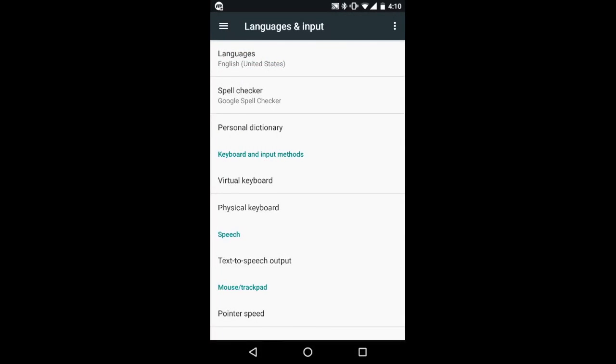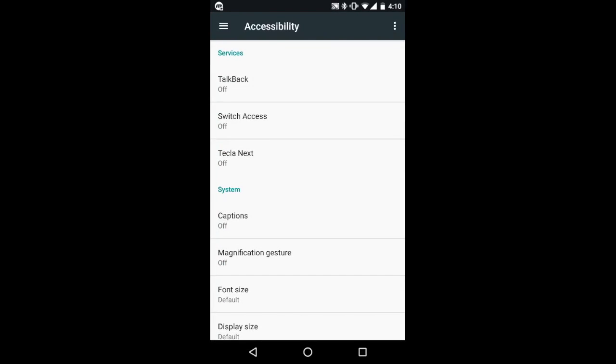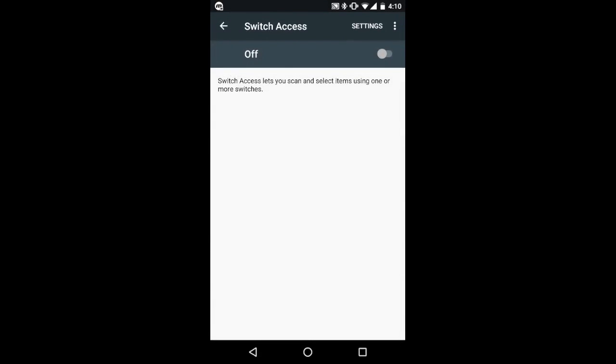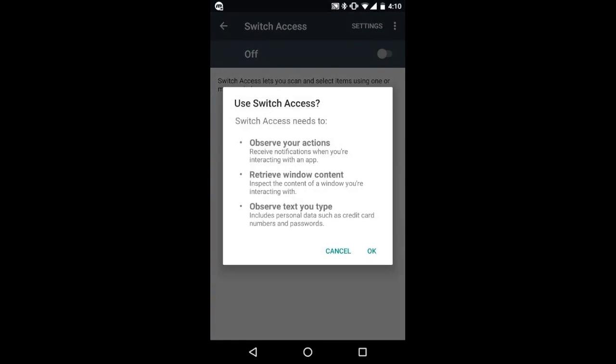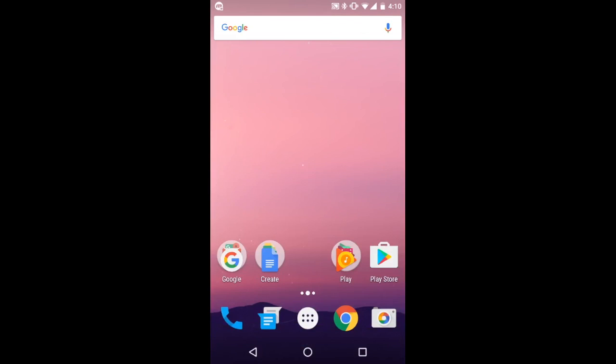After doing this, you can enable switch access. Go back to the settings menu, and under accessibility, switch access, activate switch access by clicking the on or off control.